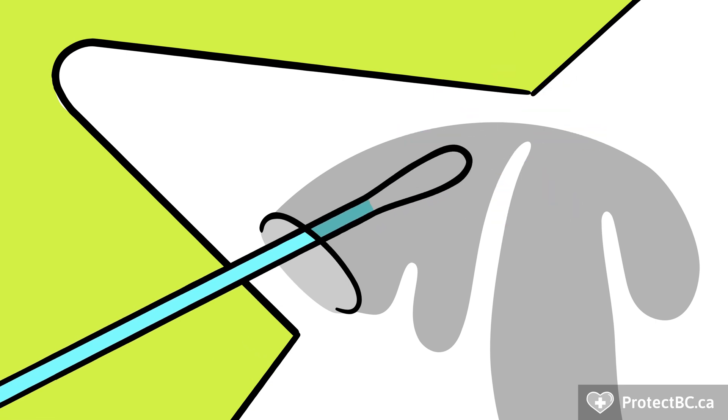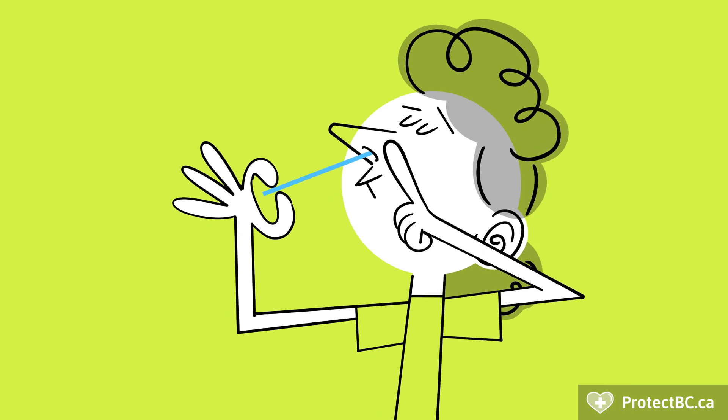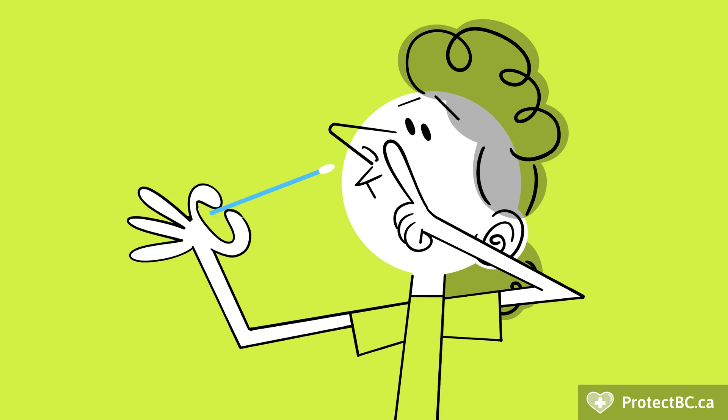Stop when you feel any resistance in your nostril, even if it is less than 2 centimeters. You should not feel any pain. You can push down gently on the outside of your nostril as you pull out the swab to get more of the mucosa sampled.